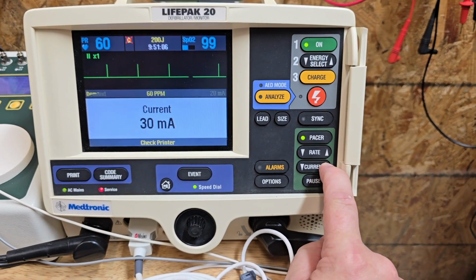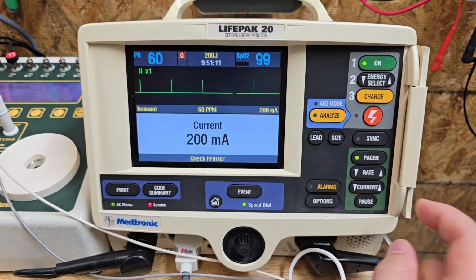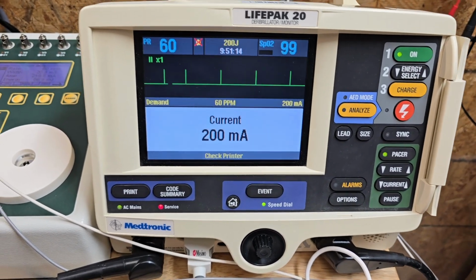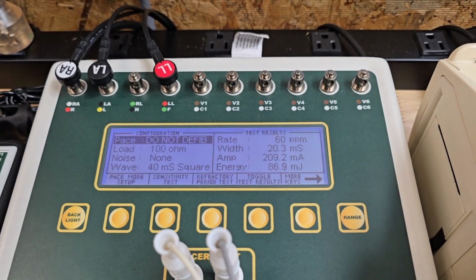Let's go ahead and turn that guy all the way up. It should go up to like 200 milliamps. Woo, this guy's smoking right about now. That's a lot of current going in there. 200 milliamps doesn't sound like a lot, but remember, all we're doing is stimulating the heart.